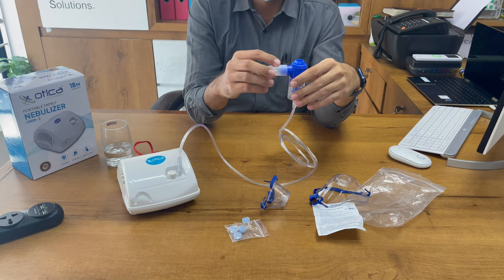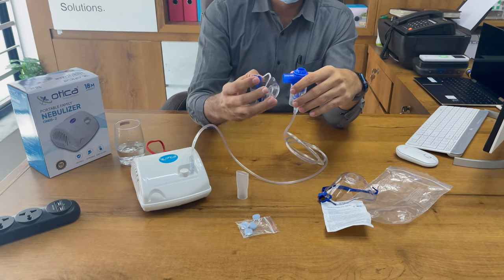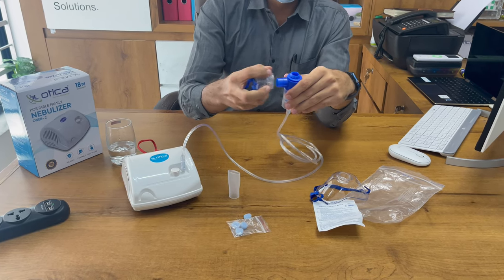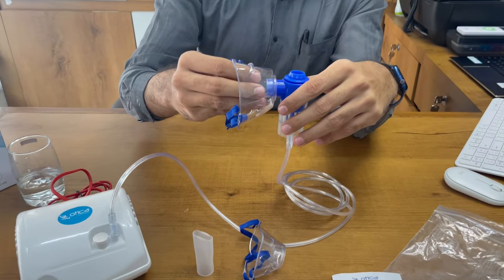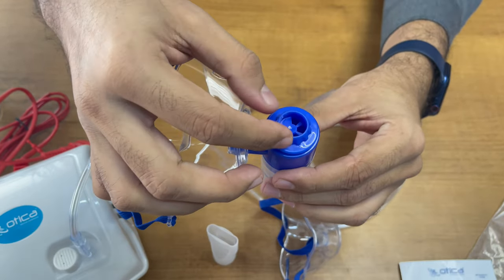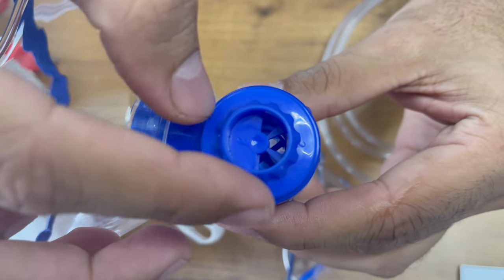There are two masks and also a mouthpiece. You can take the nebulizer directly through the mouth using the mouthpiece, or you can connect the pediatric mask, or you can connect the adult mask. You can use it with different sizes depending on the patient.